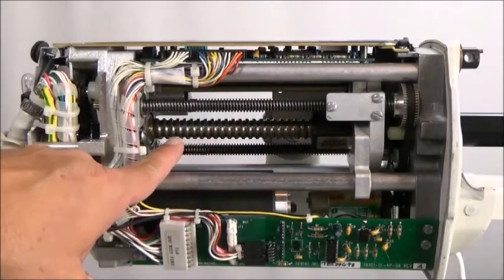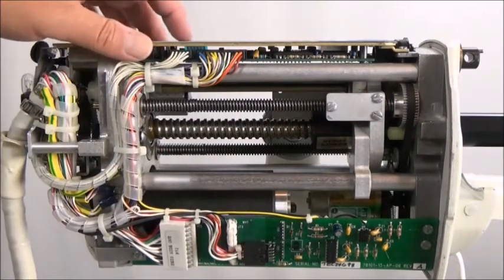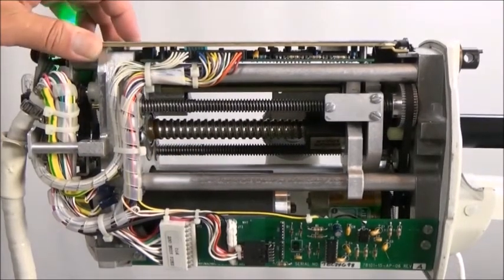Grease the main ball screw gear with any heavy grease. When finished, fully reverse the piston, then fully forward again to spread the grease.